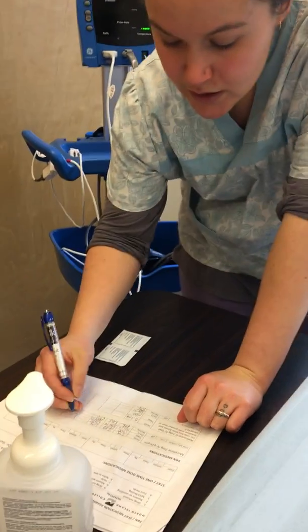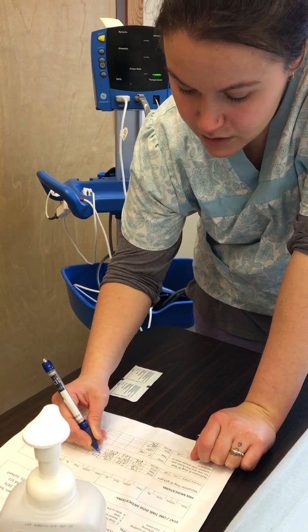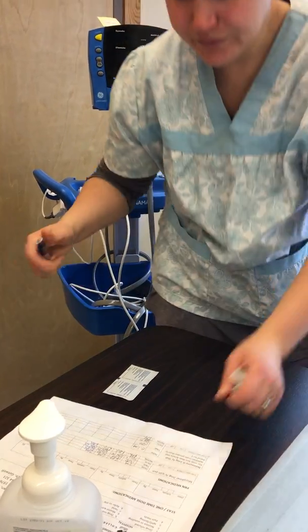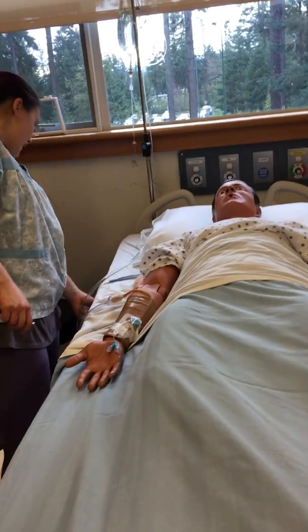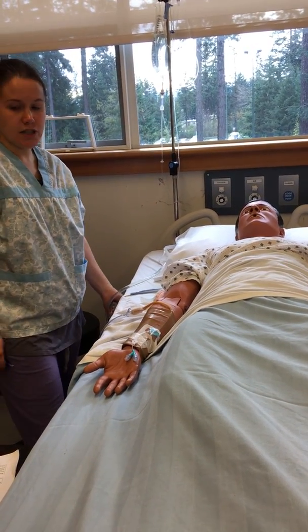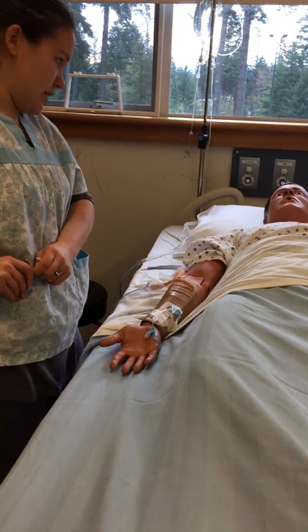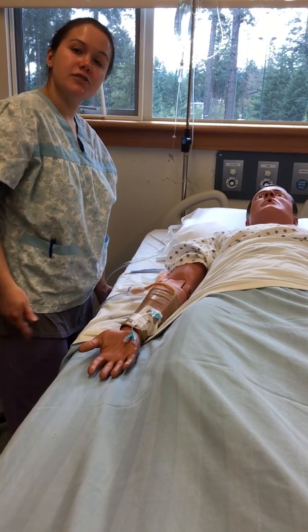And then I'm going to document by signing my MAR. I should have dotted the MAR earlier, but that's okay. I'm remembering to sign it, so that's the important part. And yeah, that's it. Oh, and then I'm actually gonna come back here in probably less than 10 minutes just to check her respiration rate again, to make sure that the respiration rate has not gone too low. With morphine, I'm just gonna do a little bit of extra monitoring of my client and make sure she's comfortable, doesn't need anything else, call bells in reach, and good, cut.